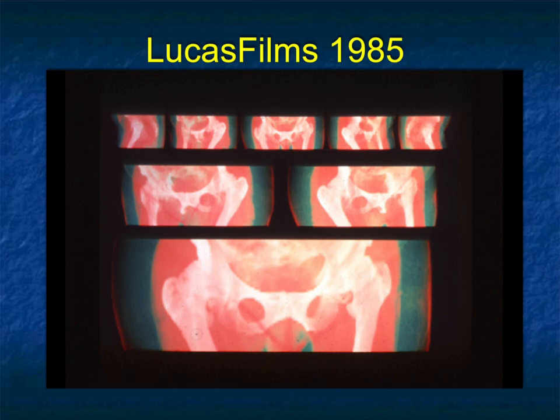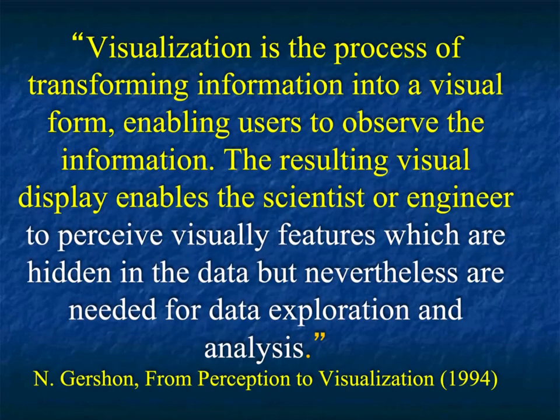Pixar had the patent on volume rendering. It was an article published by Bob Drebin, Loren Carpenter, and Pat Hanrahan a couple years later. And these were the first images that were generated. These images spun. There were 82 images generated, and it rotated. And at RSNA, when it was shown in the Philips booth at that time, people gave it a standing ovation. I've never seen people applaud for technology at RSNA. I don't care what the technology was, but for this, people did.